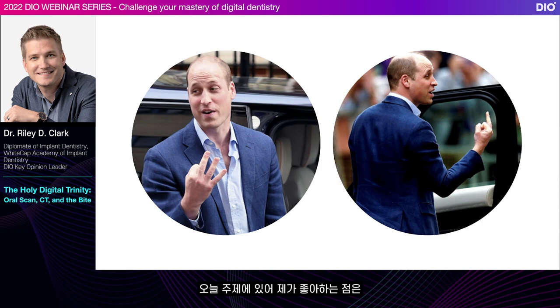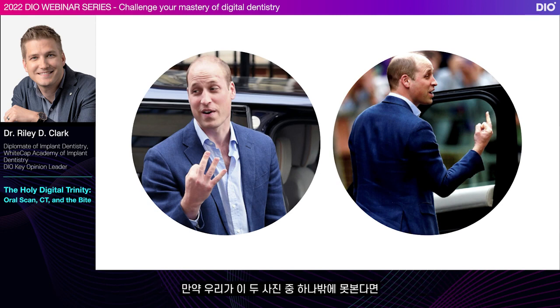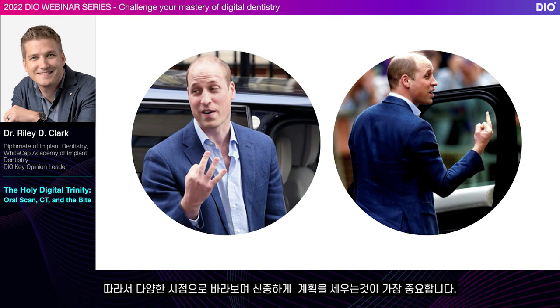What I like about today's topic is that it allows us to be thoughtfully viewing all of the patient's parameters from every vantage point. If we were left with just one of these 2 views on the screen, we wouldn't be perfectly clear with what the diagnostic tools are representing, what the treatment plan should be, and how we should proceed with the case. So having a thoughtful plan from all perspectives is most important.